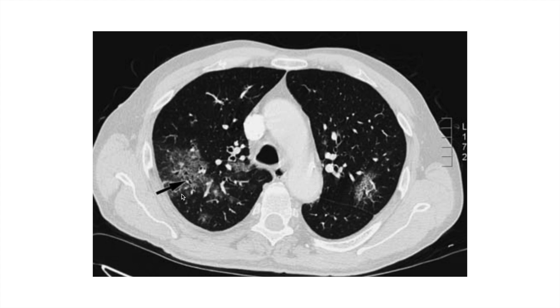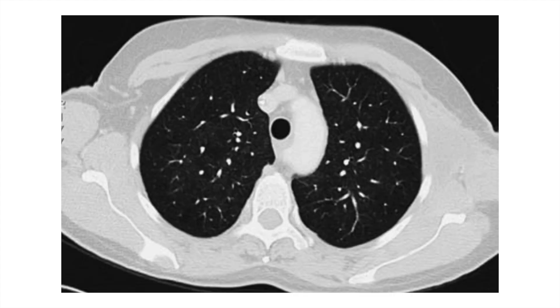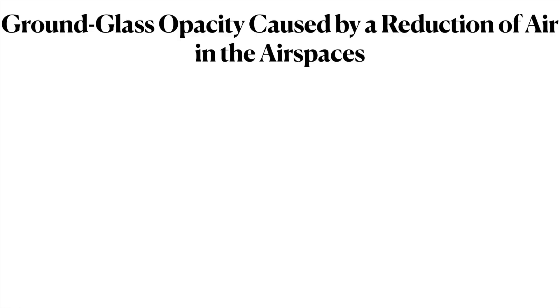This is how ground glassing looks — even with increased attenuation, the vessels and airways remain visible. A CT scan with diffuse ground glassing may look nearly normal at first, but to detect diffuse ground glassing you must compare the lungs with the air in the trachea. If you compare these two places, you'll find there is increased attenuation in the lungs compared to the trachea, which is more indicative of a diffuse disease.